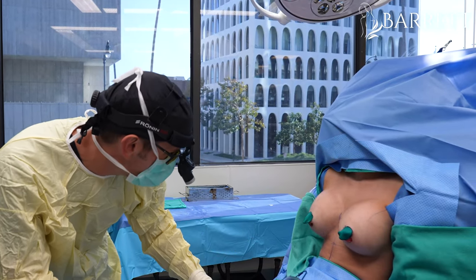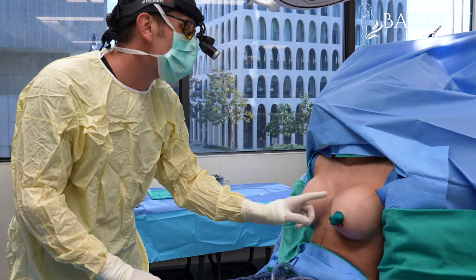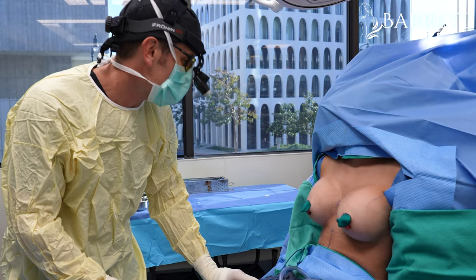We just set her up. We have sizers in — we have 350 in. It's looking pretty good. This breast is a little bit bigger, so we might need to put a 365 over here just to see how that looks.